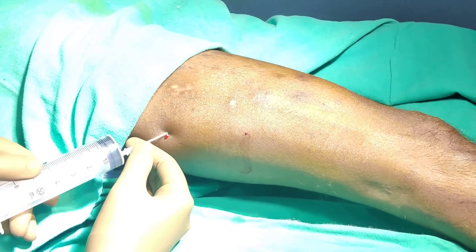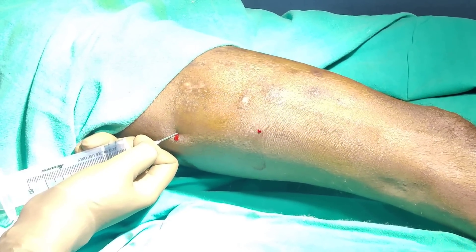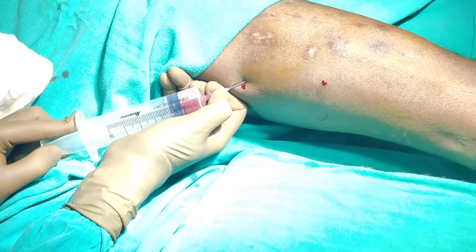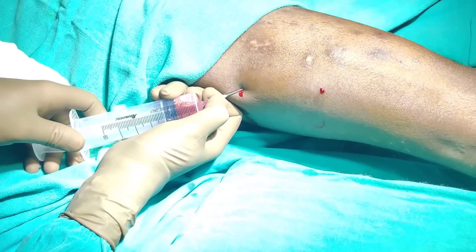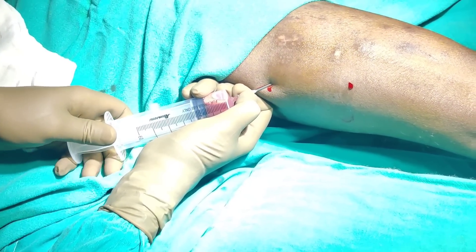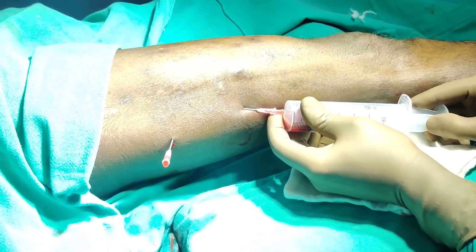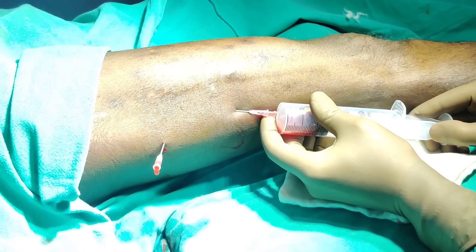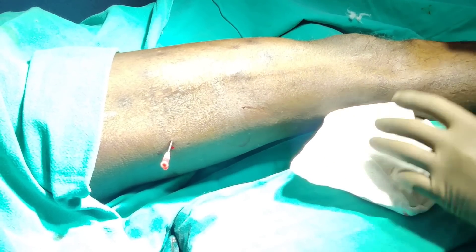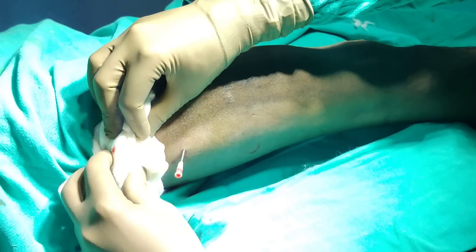After waiting half an hour, we are going to use the same track to aspirate what we left inside. Be patient and use both the proximal and distal ends to aspirate what we pushed in, then apply the pressure dressing. Repeating the same thing distally to aspirate whatever we pushed in. It is virtually empty now — very little coming out. I am pushing a little bit through the needle so that the last drop comes out.